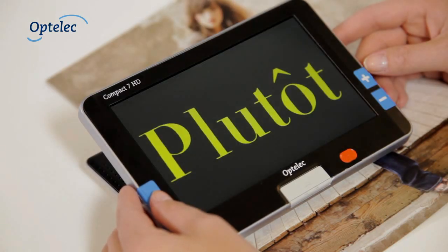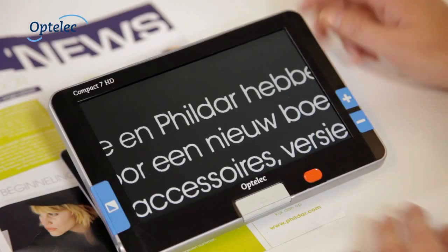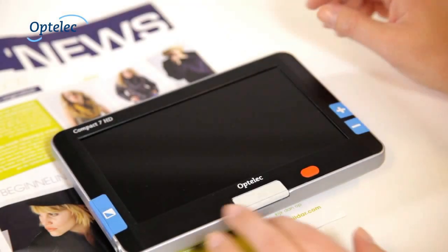Select the desired color settings to read text optimally. Press the mode button to change the colors. To switch off the unit, simply close the screen.